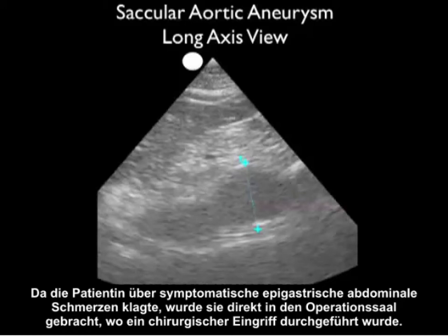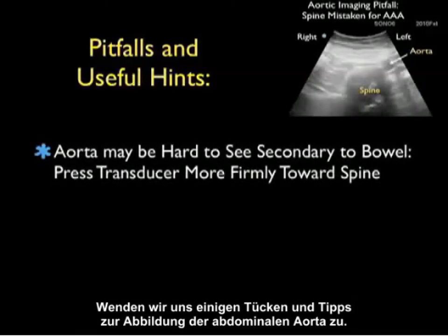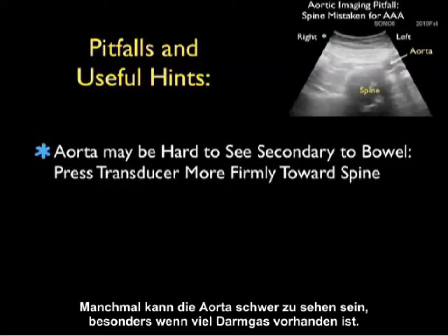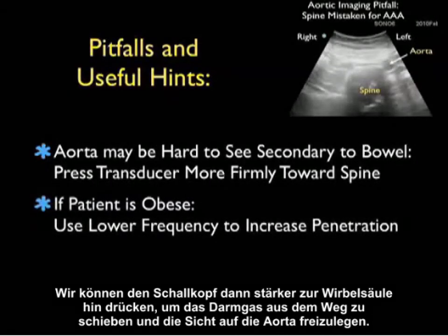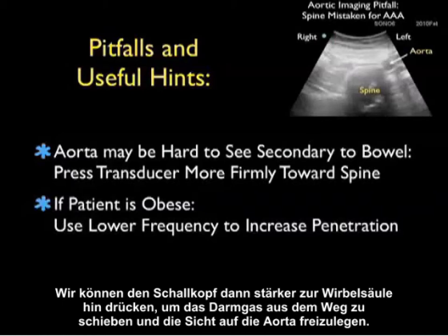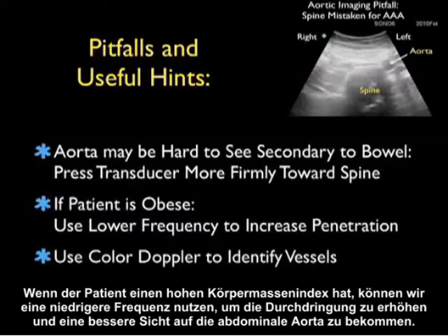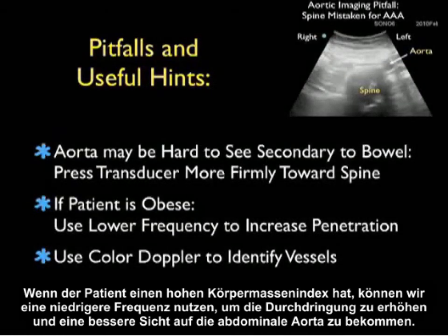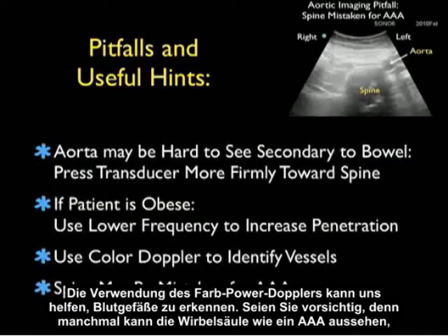Let's go over some pitfalls and useful hints for imaging of the abdominal aorta. At times, the aorta may be difficult to see secondary to excess bowel gas — we may press the transducer more firmly towards the spine to displace the bowel gas and get a look at the aorta. If the patient has a high body mass index, we can use a lower frequency to increase penetration. Using color Doppler can help us identify vessels. Be careful because there are times where the spine may look like a AAA, but close attention to the location of vascular structures anteriorly will clear that up.